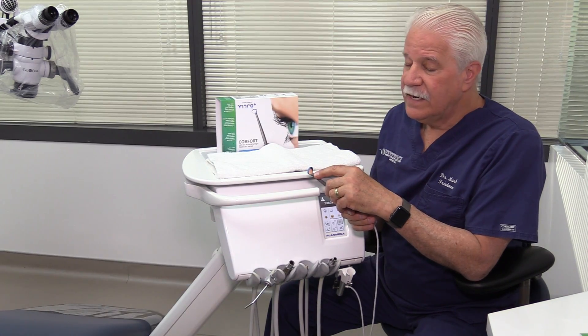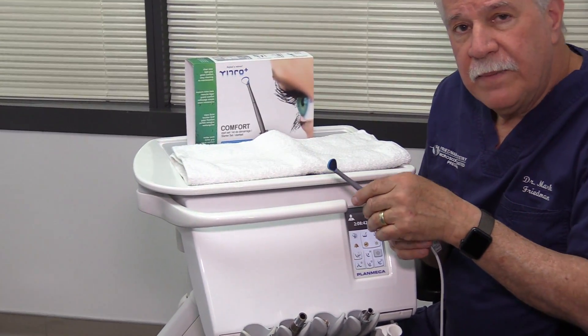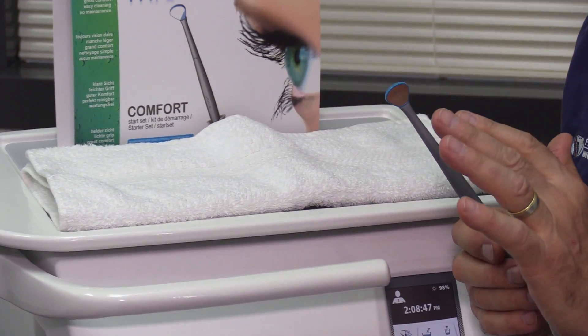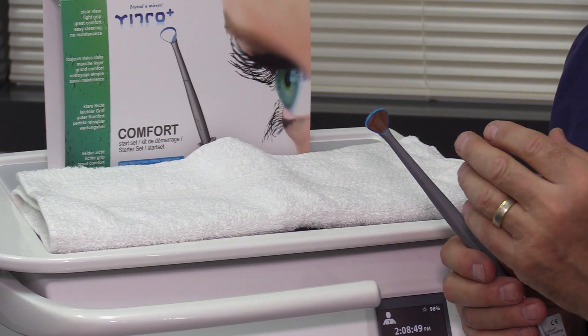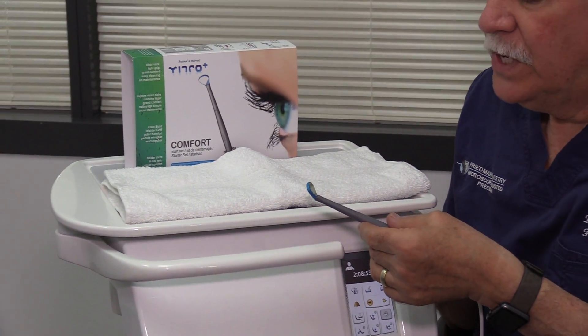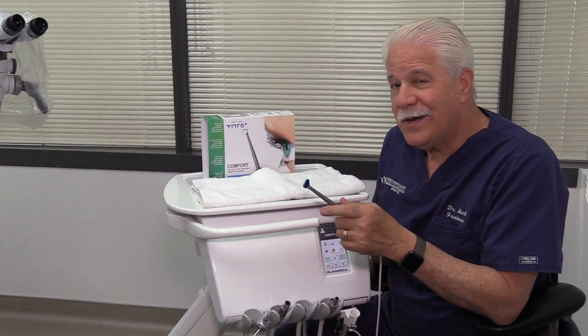There's a huge number of advantages to being able to see when you're working underwater, which is basically what this does. This tiny slit causes a laminar airflow to shoot across the mirror and keep it clear. These are really high-quality surface mirrors, and they even have a system for putting the mirror away so that it doesn't get scratched during disinfection and autoclaving. I think it's a well-thought-out system, but the proof's in the pudding — we're going to try it in just a moment.